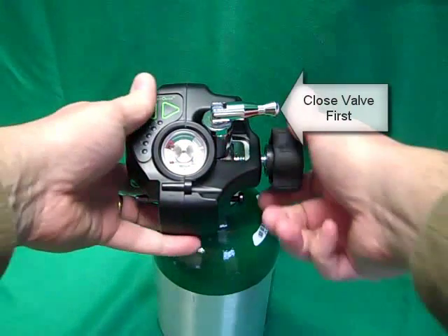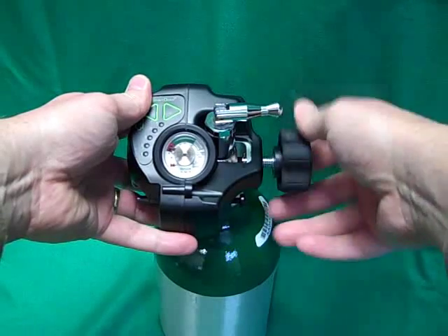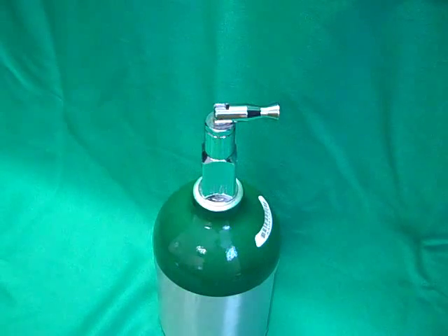To remove the unit, first close the valve on top of the oxygen cylinder. Loosen the knob fully and then apply side pressure to clear the indexing pins and lift the unit off the cylinder.